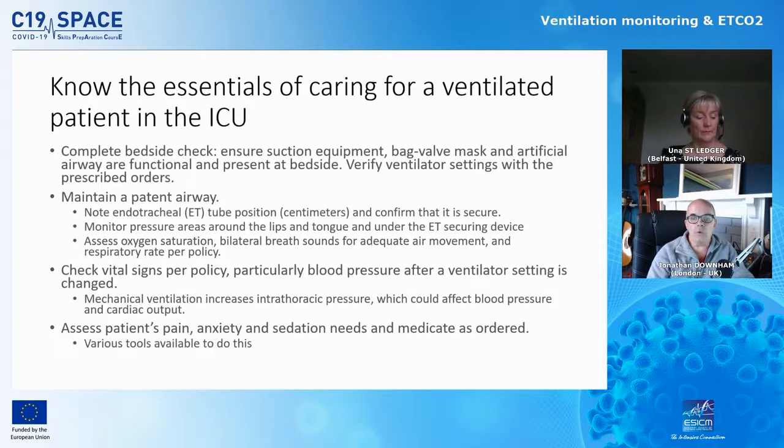You also need to assess the patient's respiratory rate. Now, depending on the ventilation setting that they're on, they can either be breathing for themselves or it's the machine doing the ventilating completely. But you need to be aware of that one way or another. What's the patient's ventilation or respiratory rate?